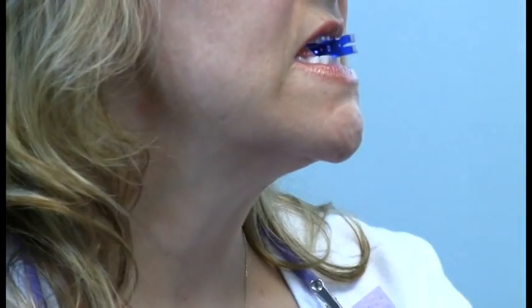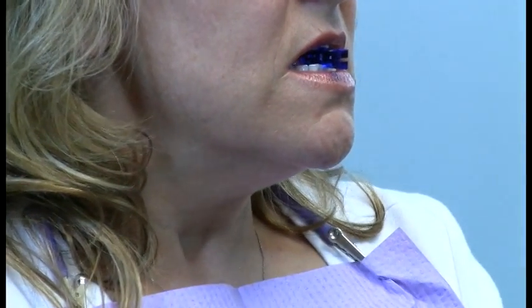Did I do that right? No, I did not. First notch on the top. It's about a 4. Okay. How's the comfort? Comfort is less comfortable. Less comfortable, okay. So the 2 and the 3-6 seems to be the best airway and within her comfort zone.